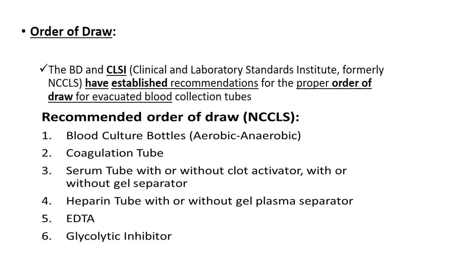This applies in a closed collection system, where the needle is inside the vein and you are putting the vacutainers one by one behind the needle. Never take the EDTA tube before the gel tube. First gel, then after that EDTA. I will show you a live example.